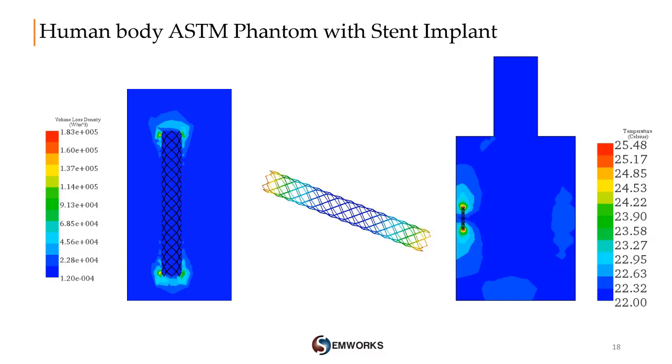Here we have the dielectric loss density distribution and the temperature rise, which is around 3.5 degrees Celsius around both stent sides. These results are considered high and unsafe for a human body for an MRI scanning period of 15 minutes.